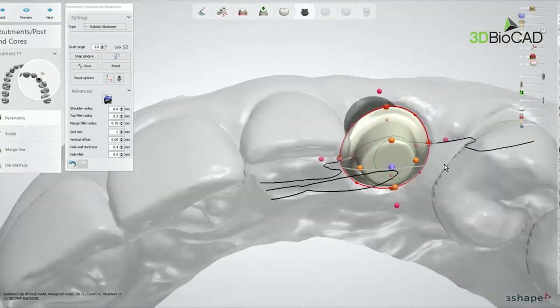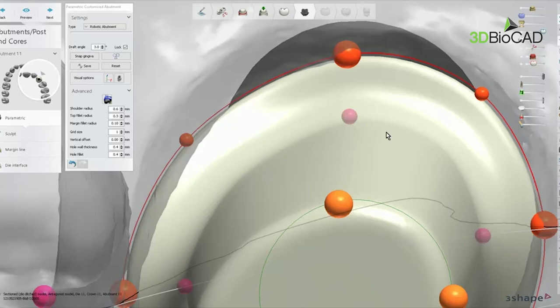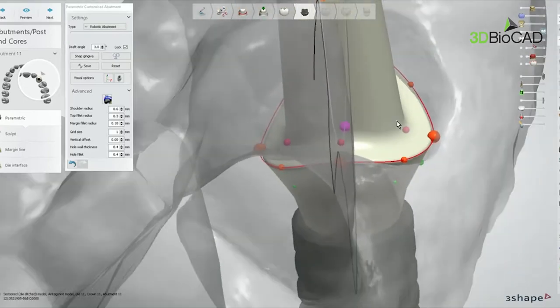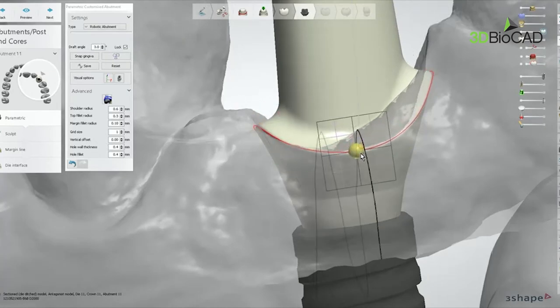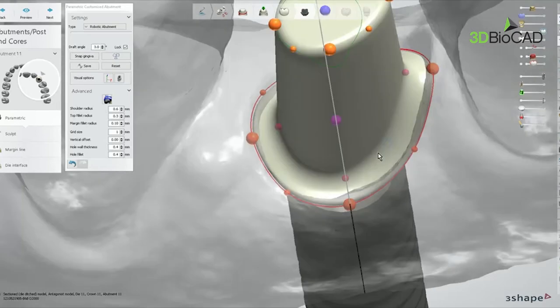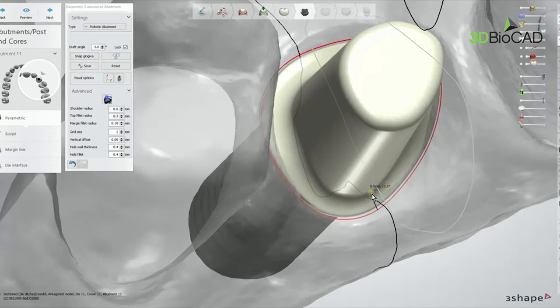Okay, let me do it quickly. And then here, which color is it, a little bit pinkish. We can see how wide the shoulder area is. So for titanium, silver color, if you want to cover the titanium color well, we want at least 0.6 or 0.8 millimeter distance from the margin to the abutment. But if you don't have room, of course we can go out. We can see how many millimeters we have for the crown contour and crown thickness.